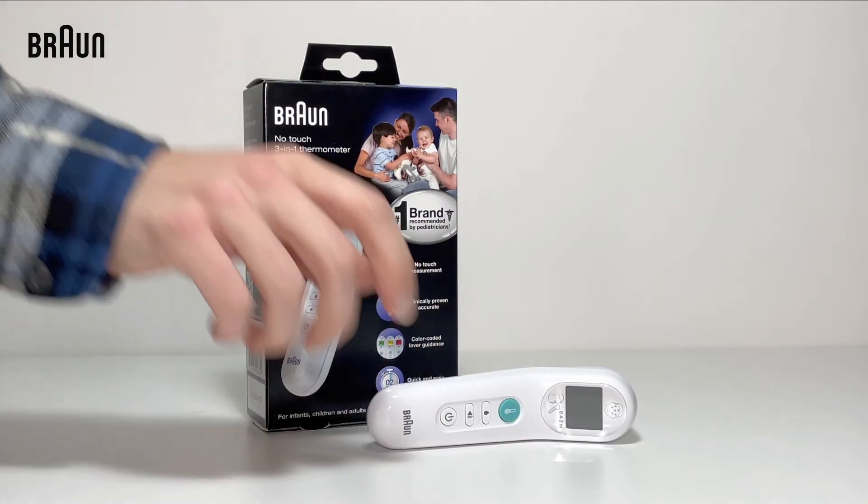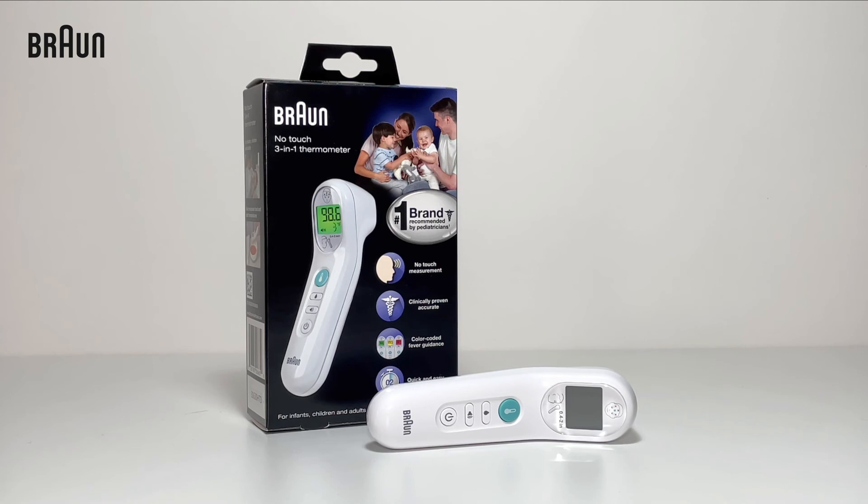After wiping, allow the thermometer to air dry. Be sure to wait 10 minutes before taking a new measurement.